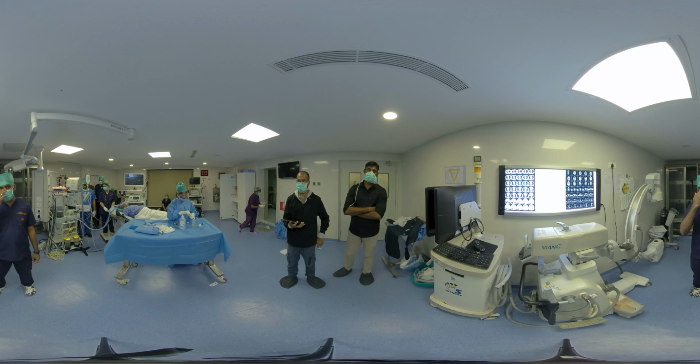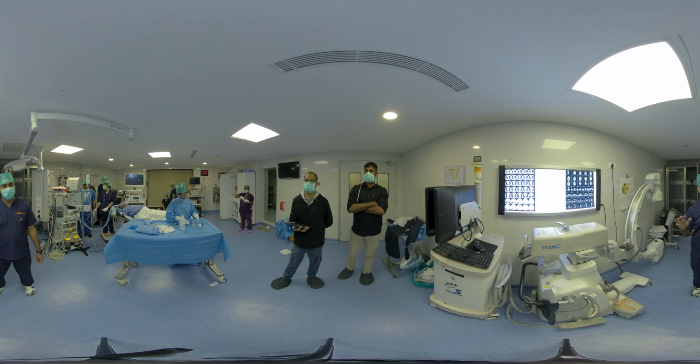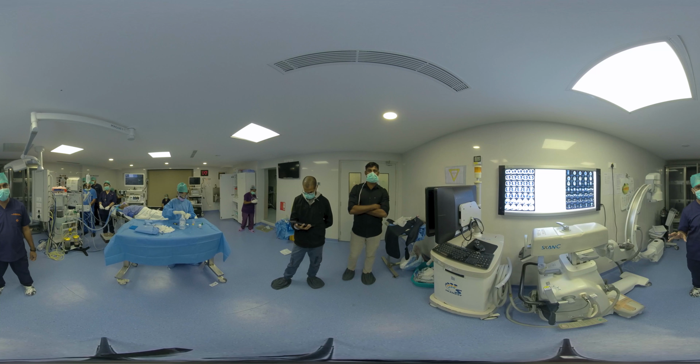Now you have seen a case of cryolung biopsy of a lung mass. The important precautions here are that we need to always try to do it under rigid bronchoscopy, and the Fogarty should be in place for adequate tamponade.